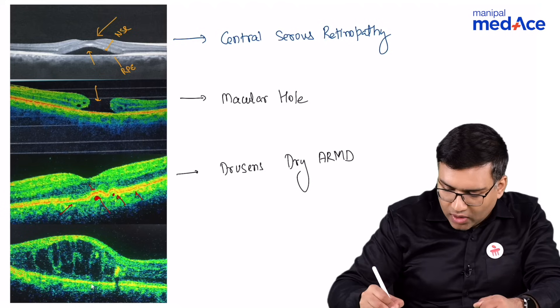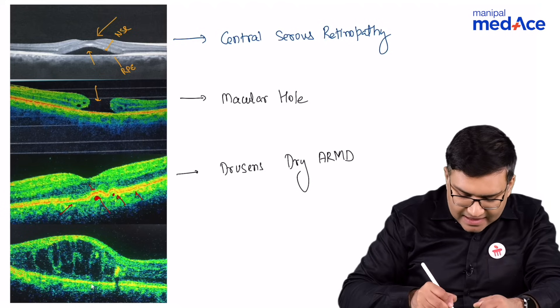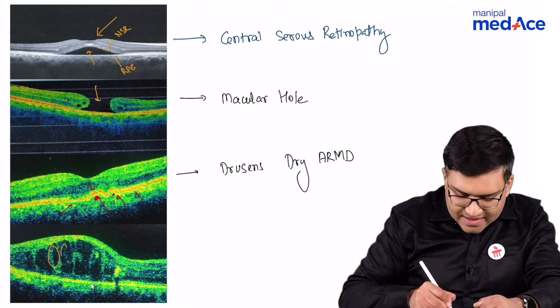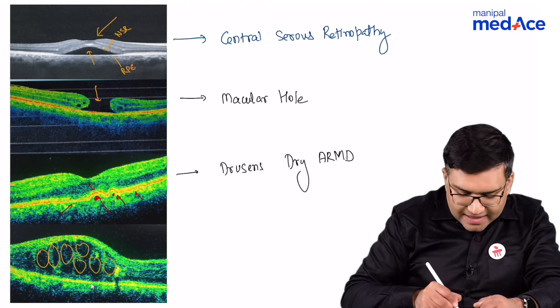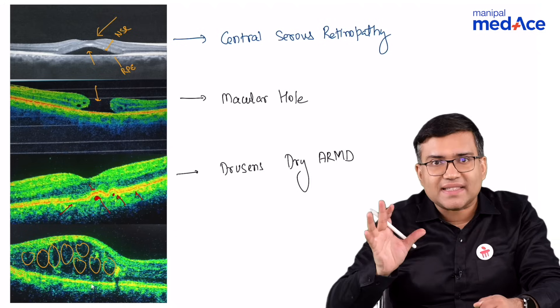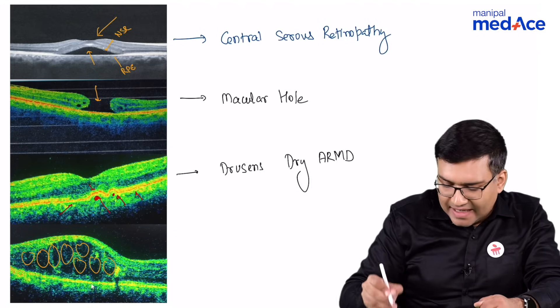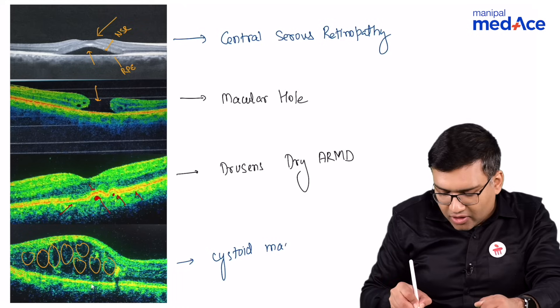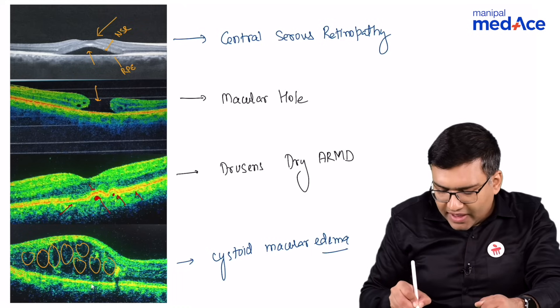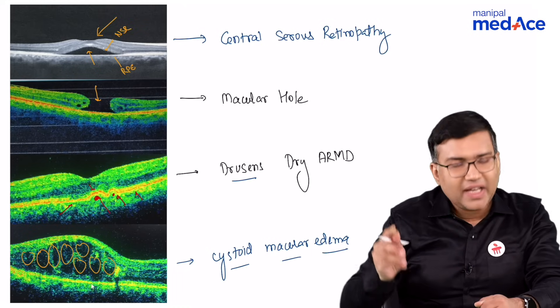See the last image. What you can see here is that there are cystic spaces in the inner retinal layers. Whenever we see cystic spaces in the inner retinal layer, that means we are dealing with cystoid macular edema. Remember these very important OCT pictures of the various macular disorders.